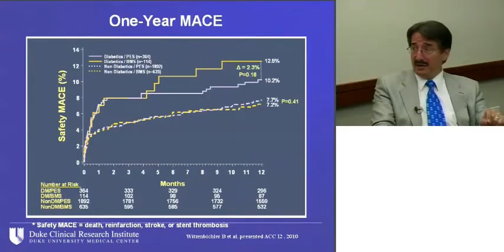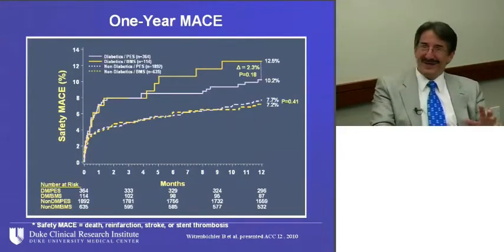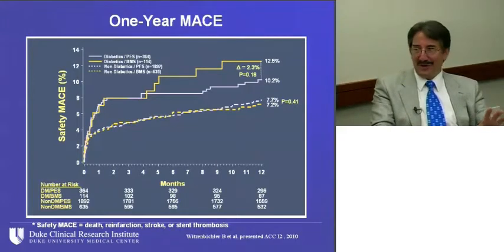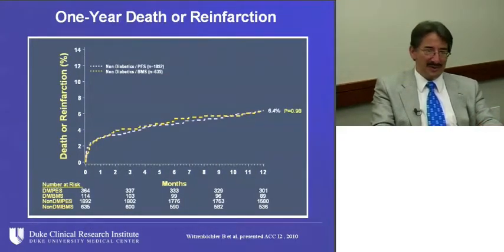P of 0.18, is that really a trend? I think right now we can say there's just no apparent difference, at least in clinical outcomes. Now, is that good? Is that preserving safety while lowering restenosis? Or is this telling us that we're lowering restenosis, but we're not really treating what actually is going to bother the patient over 1 year? We can come back to that maybe with our patient here today.